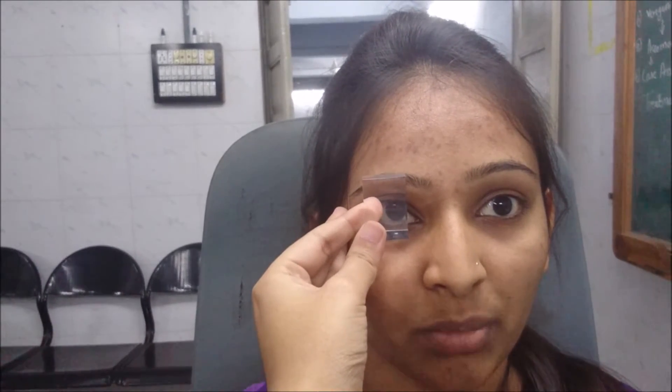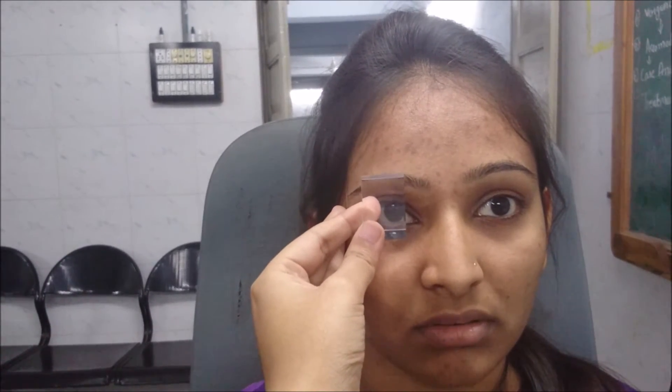The next test involves placing a prism in front of the good eye. The patient is asked how many images they can see, and they report two images. This means that the malingering eye is able to see.